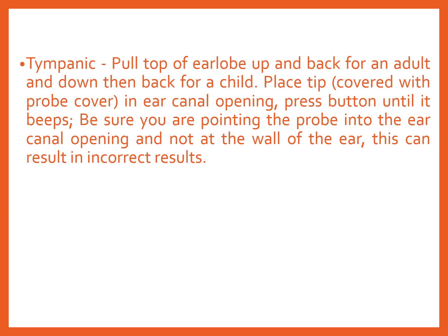So we will talk about the tympanic temperature, the one where you put it in the ear. You need to pull the top of the earlobe up and back for an adult, and down and back for a child. Place the tip, covered with a probe cover, in the ear canal opening. Press the button until it beeps. Be sure you are pointing the probe into the ear canal opening and not at the wall of the ear, because this can alter the results.